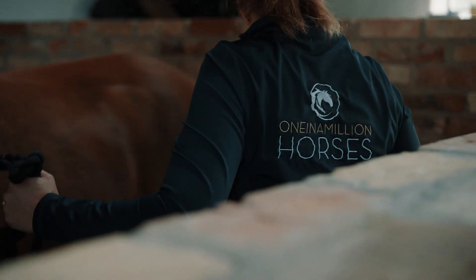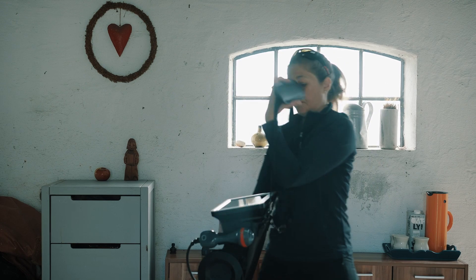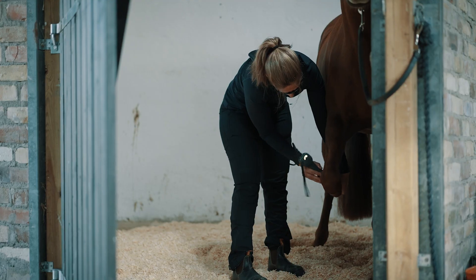I've been working with laser treatment for around two to three years. The type of problems I treat are like tendon injuries — the suspensory ligament is a common issue.